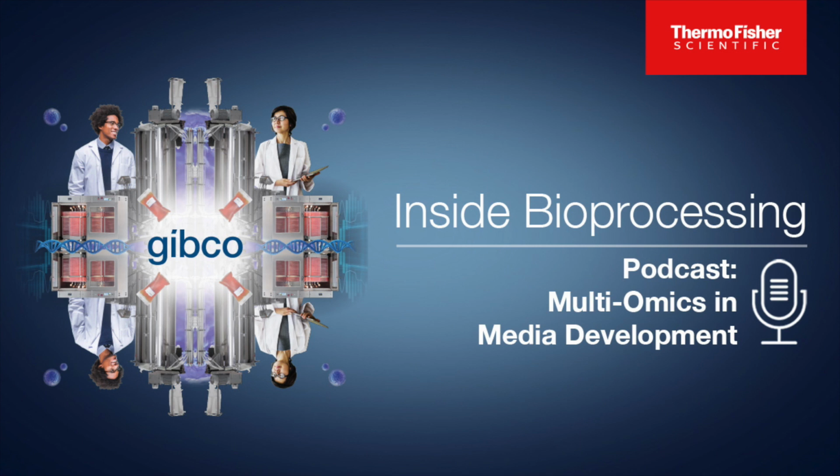So now looking at some of the implications and the impact of multi-omics specifically for the biopharmaceuticals industry as a whole. Paul, are there any areas where technology development, such as within data science, could help advance multi-omics? Yes, absolutely, there is. As you can imagine, when we have made this transition from a spent media approach, which is going to produce a certain amount of data and information for us to be able to use, to a multi-omics approach, the amount of data and the depth of that data has increased exponentially.